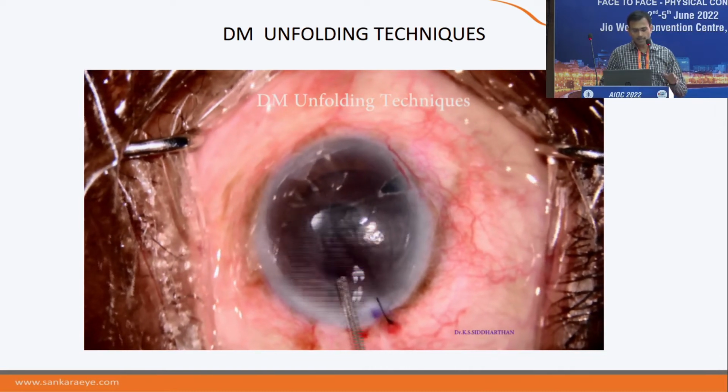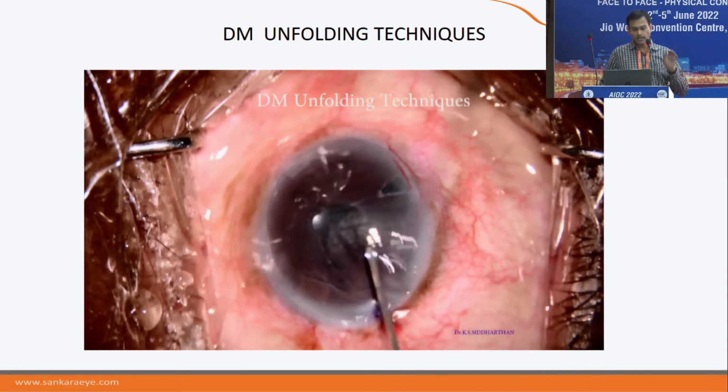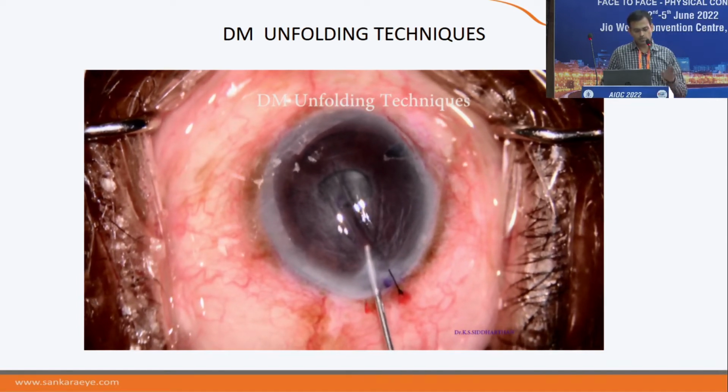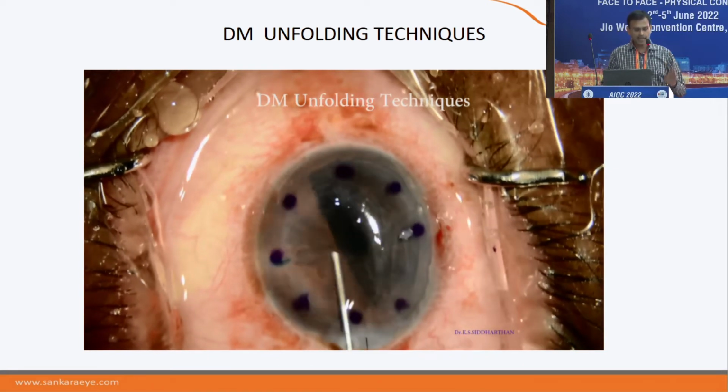And the mark, as I showed you, is what was guiding us. And as Vikas was telling, initially everybody starts. I started in 2013, stopped, and restarted in 2015 after I saw the marking. So once the mark is there, it makes your life very simple. So this was the initial tapping one.